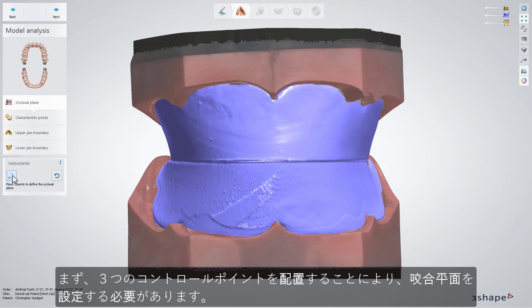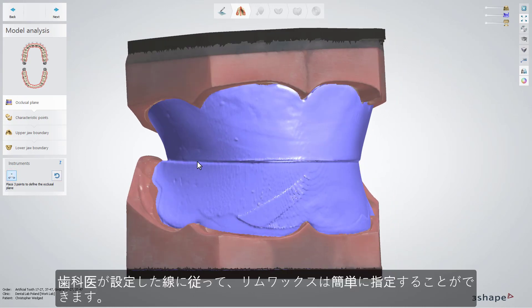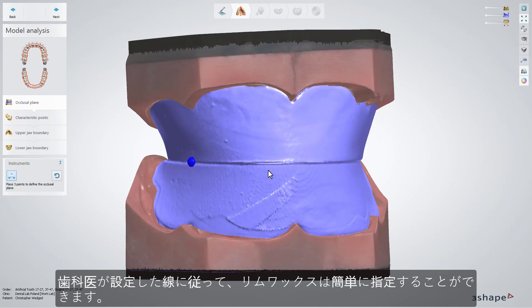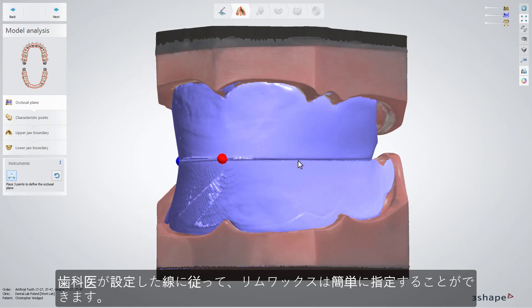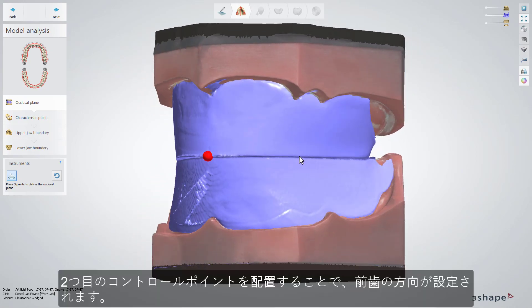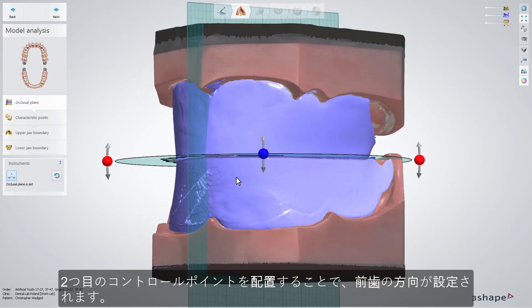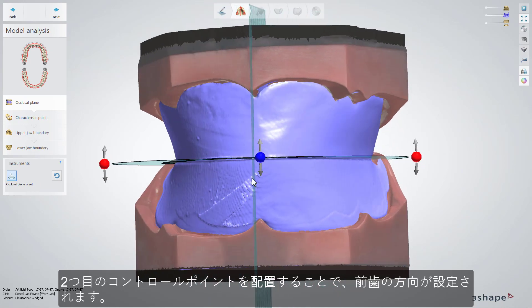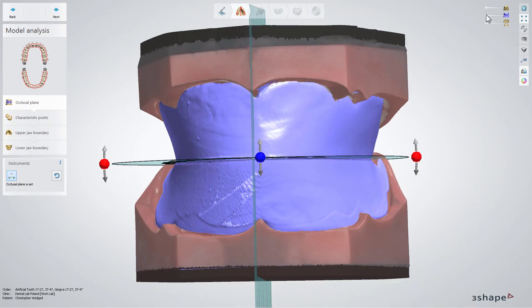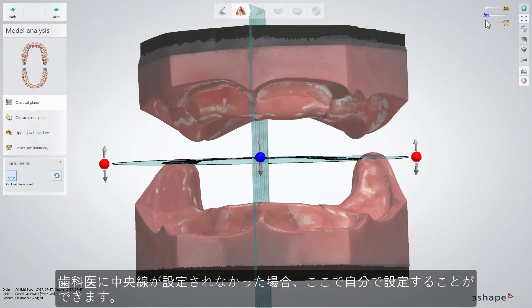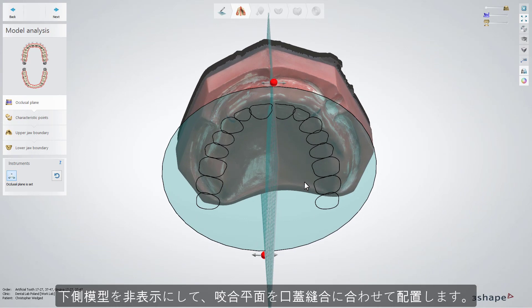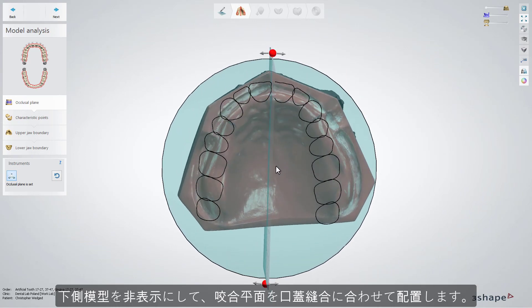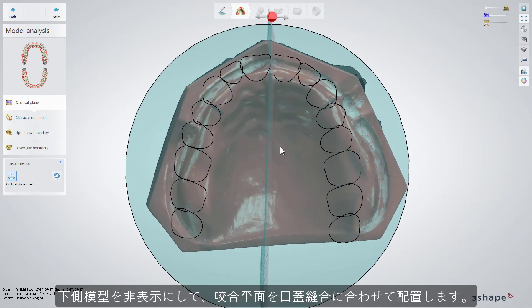At first we need to define the occlusal plane with the help of three control points. You can see that our wax rim comes in very handy, defining it easily by following the line which the dentist has arranged. Keep in mind that placing the second point defines the direction for the front teeth. If the middle line wasn't defined by the dentist, you can verify this yourself. Make the lower model less visible and place the occlusal plane in relation to the palatal suture.